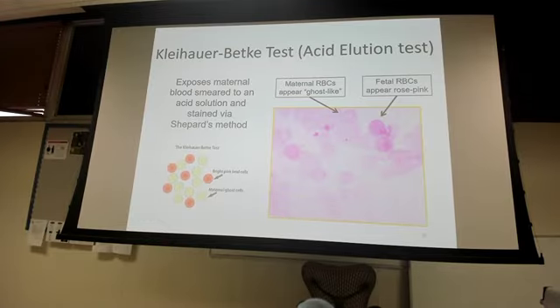So if you detect that one of your pregnant patients has a fetal hemorrhage going on, this is what we'll see under the microscope. Her RBCs will look ghost-like, very light and shadowy, and then you can see the baby's RBCs will be really dark and small.